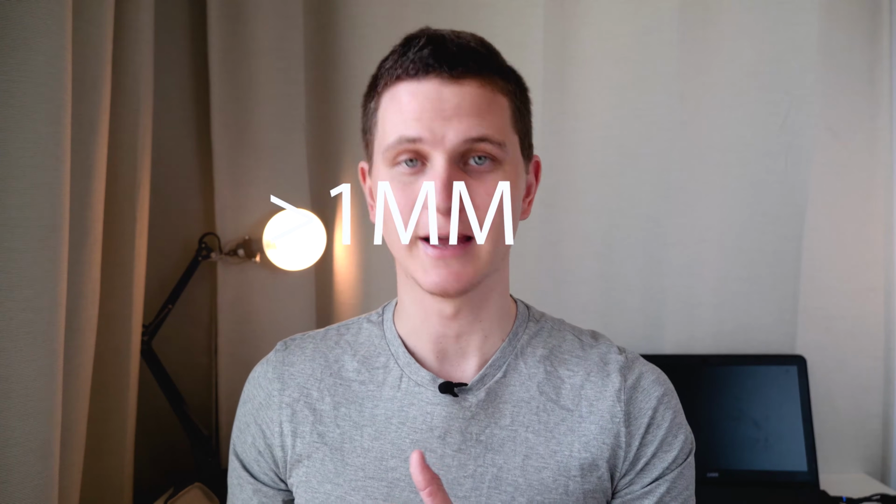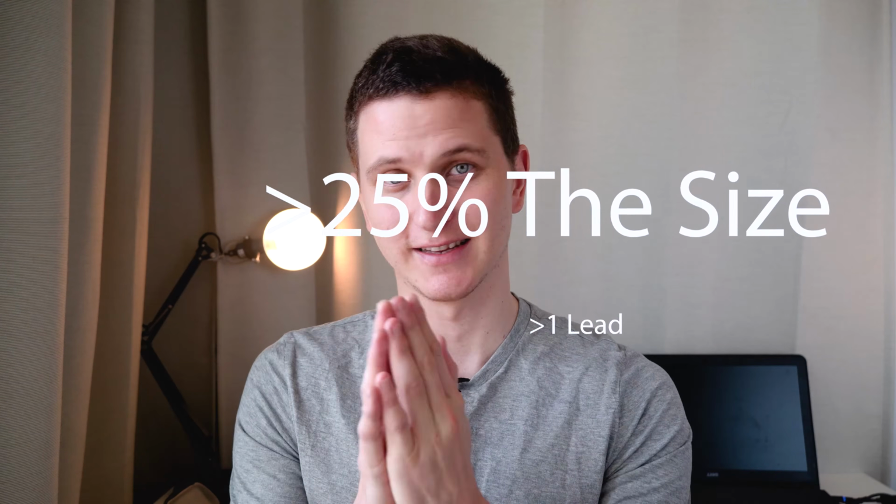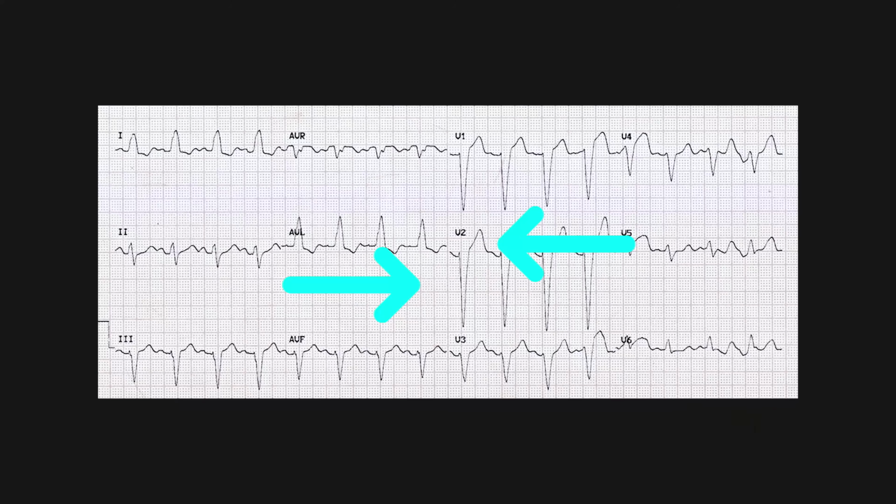The third criteria for your modified Sgarbossa criteria is that you have discordant, so your QRS is negative and you have ST elevation of greater than 1 millimeter in more than one lead, which is at least 25% the size of the preceding S wave. So you look at the previous S wave and you say, is my ST segment elevation at least 25% the size of the previous S wave?